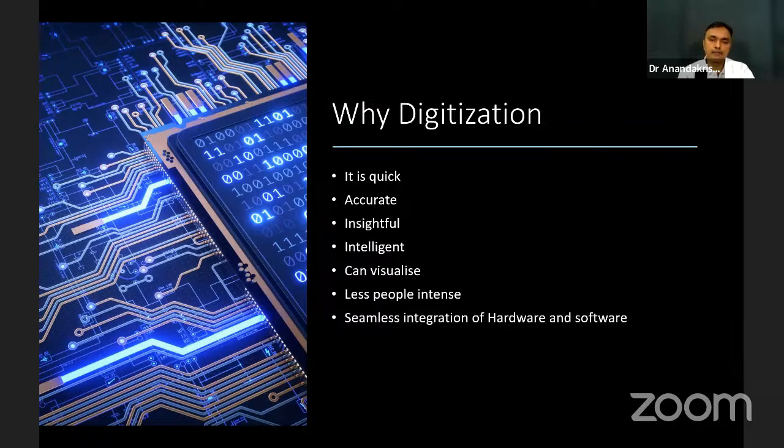We can integrate data from the facial scanner with photographs, with the CT scan, with the intraoral scan. We can do all the integration of data and we can actually put it out there into the software. The software will allow you to manipulate and give option 1, 2, 3 to the patient as to how the final outcome would be. So you can do a multitude of these things just in the software environment. You don't have to physically do wax ups anymore. You don't have to physically do impressions anymore. You can just bring all the data onto the software environment and you can work with it.